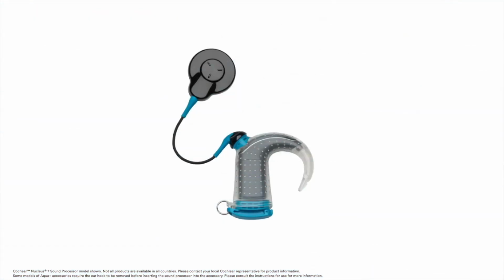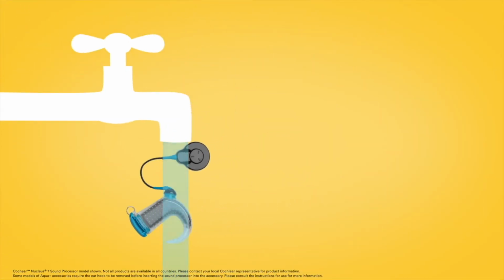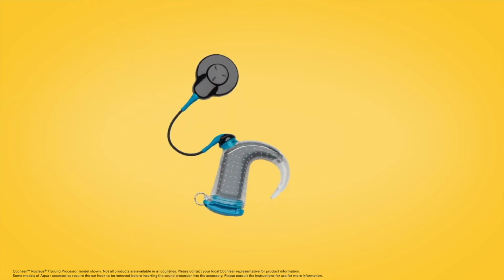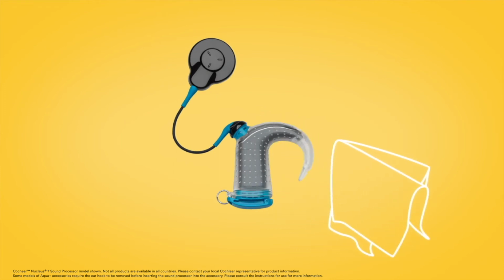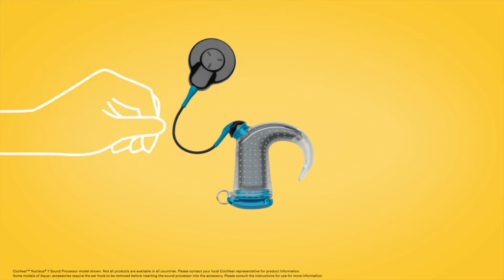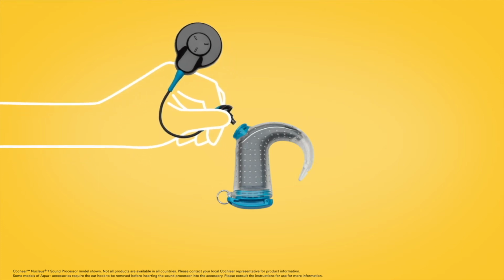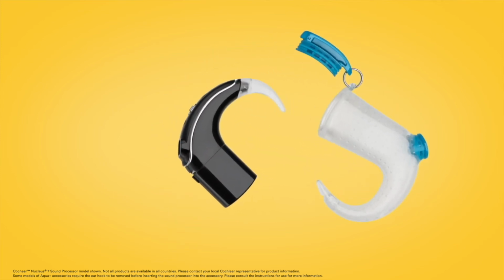When you're finished in the water, make sure that you rinse Aqua Plus and the Aqua Plus coil with fresh water and dry with a soft cloth before removing the sound processor. To unplug the blue Aqua Plus coil, grip the black ring on the coil connector and pull the plug straight out. Then, open Aqua Plus and remove your sound processor.